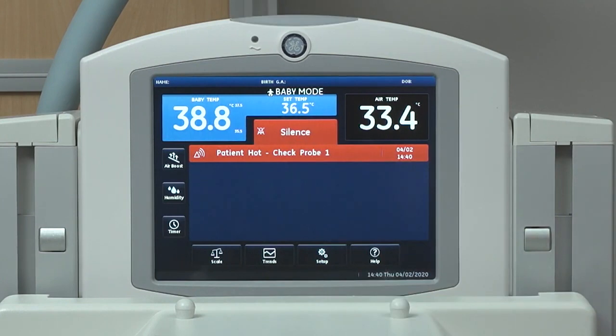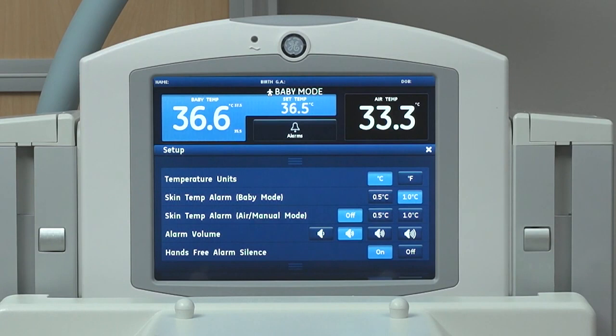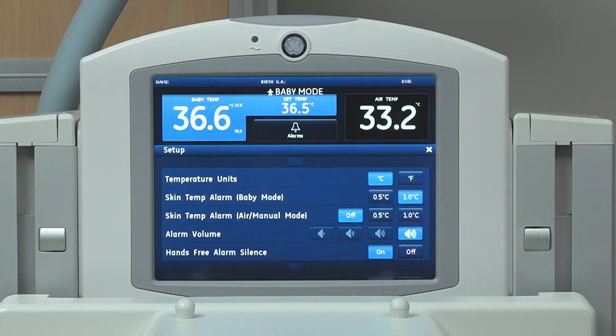Alarm settings can be adjusted by selecting Setup, then select Alarm Volume to adjust the volume. You should take into consideration the environment and how the noise level may change depending on where the bed is located.